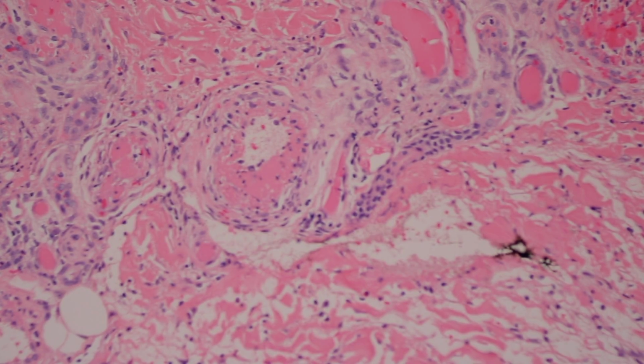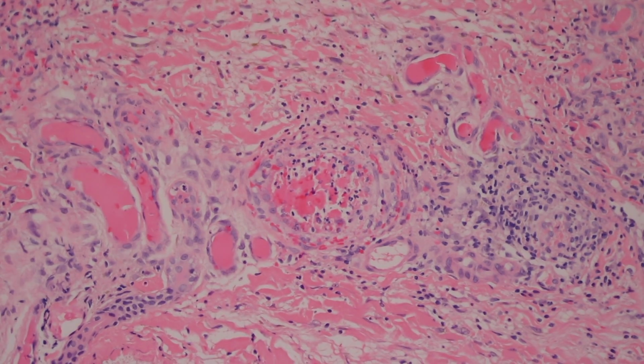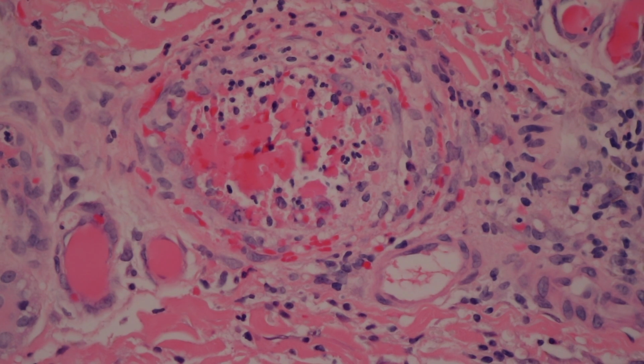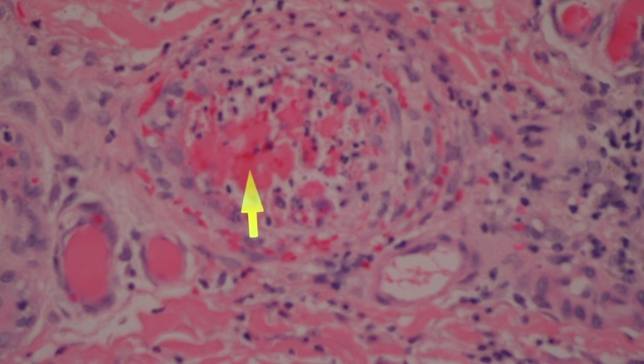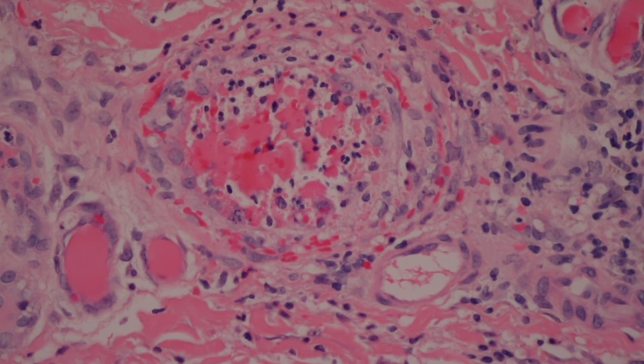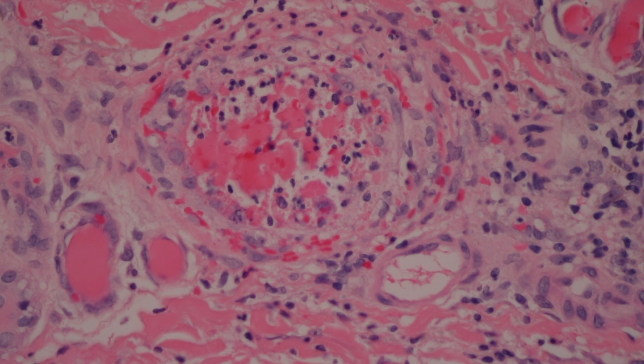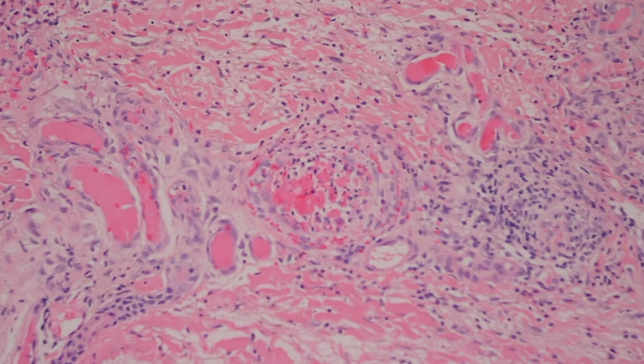Now, at first glance, this might look like fibrin. And in fact, some of it probably is fibrin. But in addition to fibrin, some of it, and you can see these little islands of it floating here. Let's see if we can get closer. You can see there are neutrophils in and around the vessel, but these pink areas here are a bright pink. I'm not sure if it shows up well on the video as it does microscopically, but they look a brighter pink and more homogenized and glassy looking, or hyaline looking, we say. Hyaline means glassy.